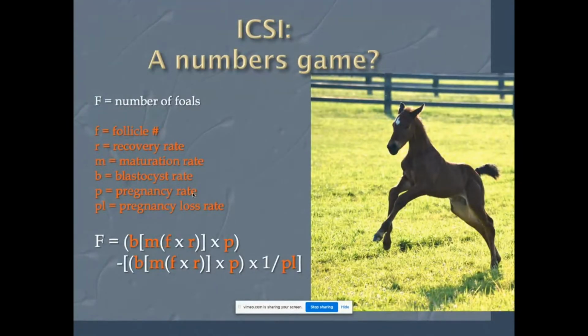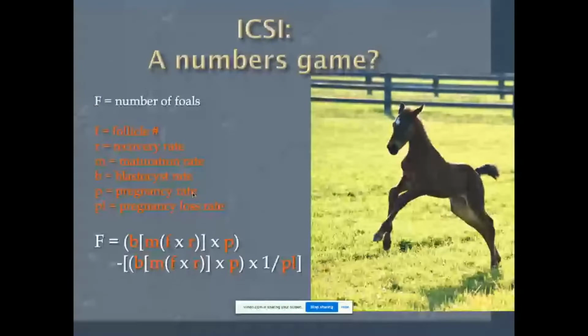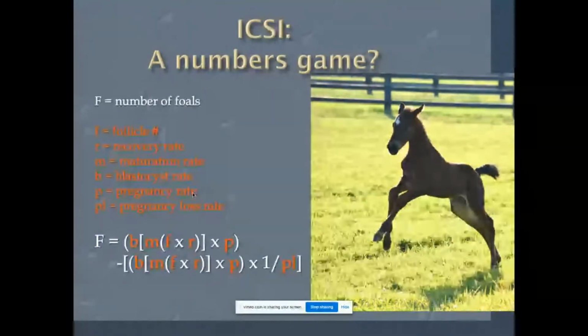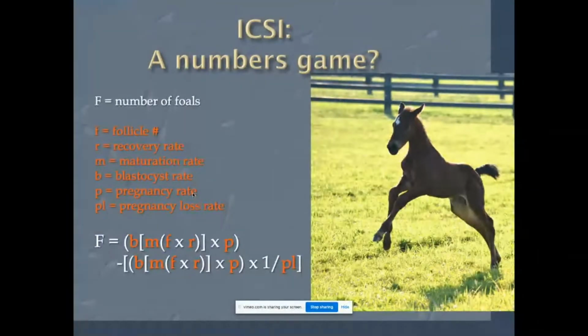So pretty much our mare identity affects almost every spot in this equation. Actually, the guy that gave me this pseudo equation was lucky enough he got 5 embryos his first aspiration, and of course he had it all figured out. The second aspiration he had 0, and so there went the equation.